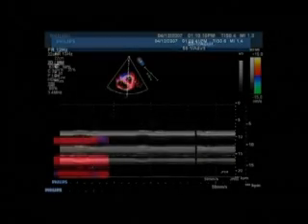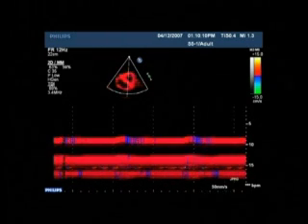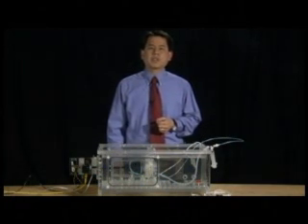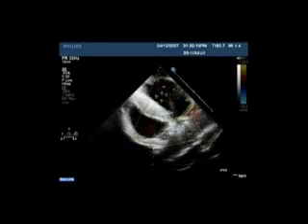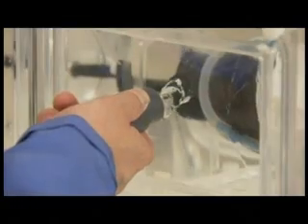Enabling tissue Doppler, you can see the tissue velocity displayed as a color overlay, and from these imaging modes you can appreciate the displacement of the phantom structure at opposing walls as a function of time. Switching to B mode imaging, we can see the structure and dynamics of the phantom within any 2D slice of interest, and also, turning on color Doppler, we can visualize fluid motion within the phantom chamber. Finally, with real-time 3D imaging, we can visualize and quantify volumetric structure and dynamic behavior, and in addition, we can manipulate interventional devices being moved within the chamber anatomy under image guidance.